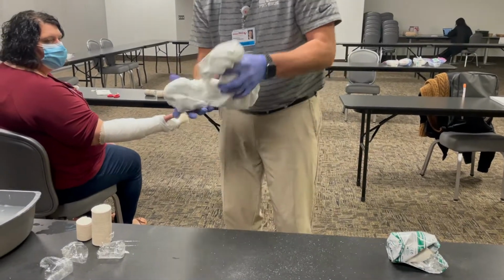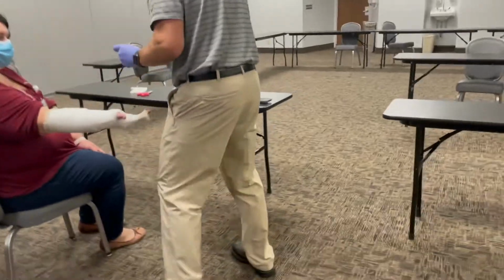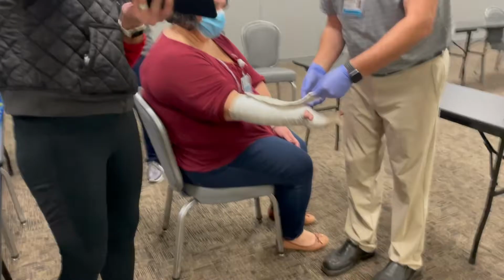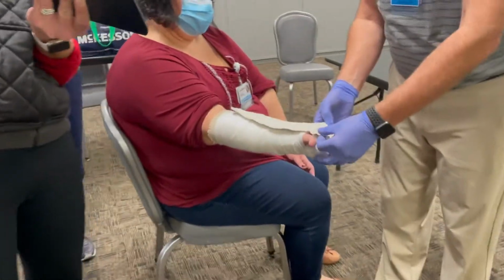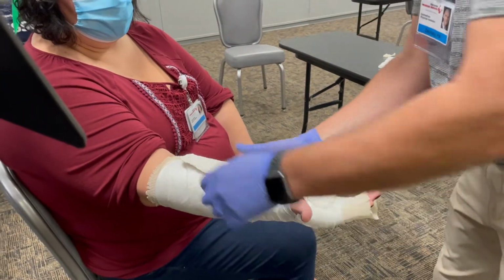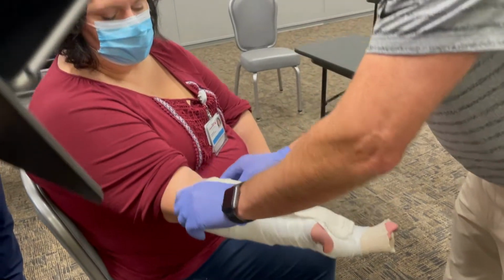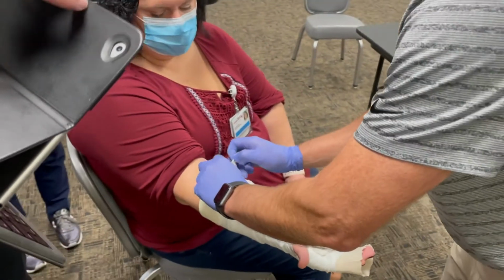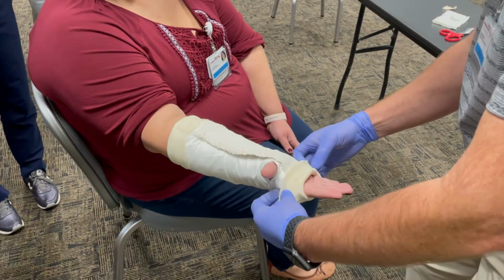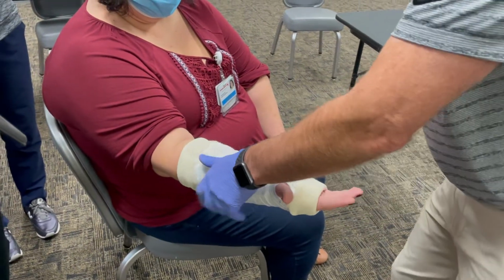Okay. And we're ready to put her on there. I'm kind of stretching it out now because that looks good. So stay off the skin. See that right there, how I got kind of close to her skin? There we go. And you can go ahead and pull this down now if you want. Then you got her all covered up, so there's no area that's going to pinch. See that, guys? What's that netting called again? Stockinette. Stockinette. That stuff makes it look really nice.